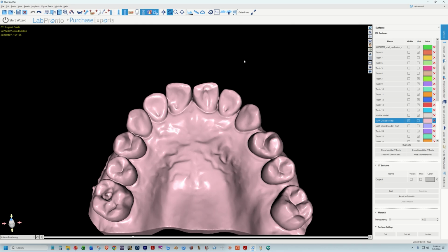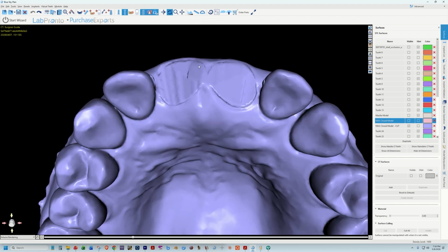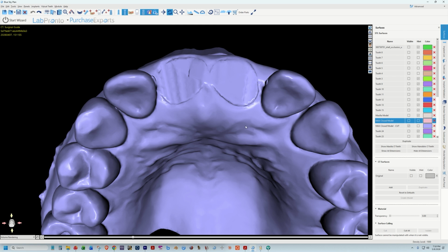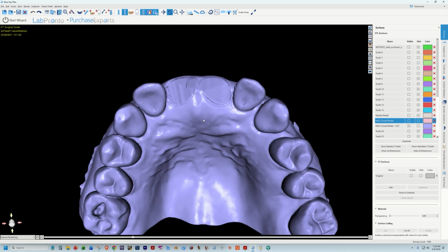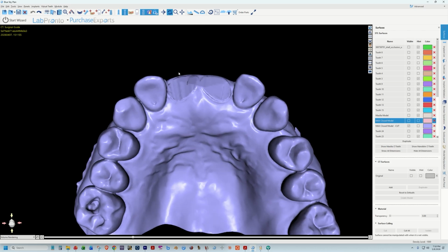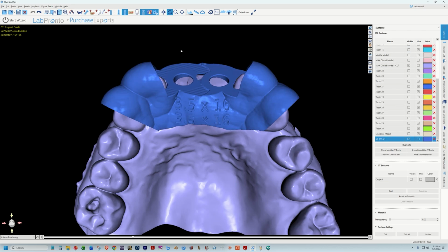So I did the cutting already, and prior to cutting, I duplicated the model, and I came up with this model. Okay, this is very closely trimmed, as you can see. I made sure not to cut into the mesial of the lateral incisors because I want to make sure my guide fits at the time of surgery. So when the patient arrives for surgery, get her numb, carefully take these 2 teeth out. Then the surgical guide goes on. All right, looks like this.